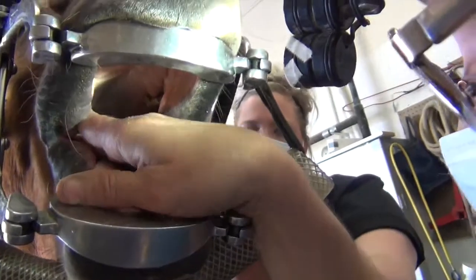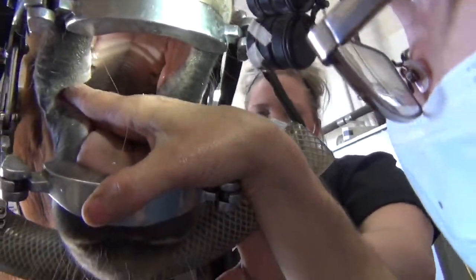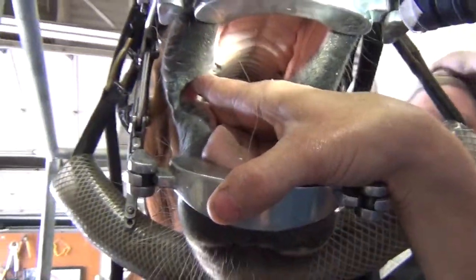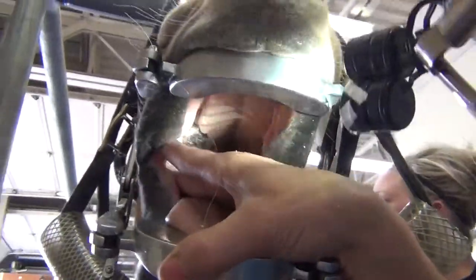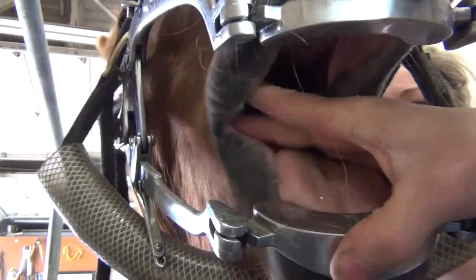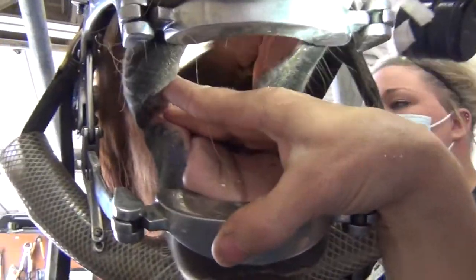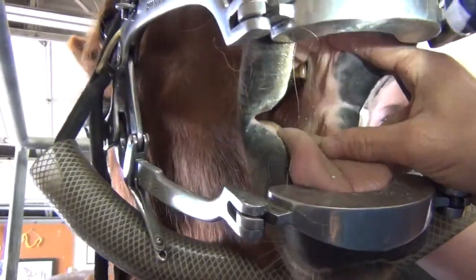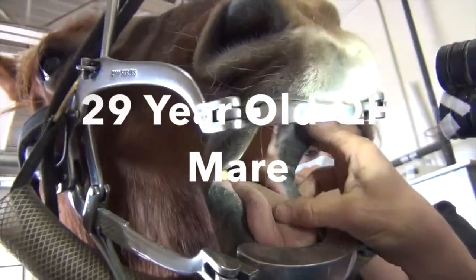for her. One of the things we look for when we're looking at the teeth is how well are they aligned and how evenly are they worn. And if there's uneven wear, then we're going to try to help correct that and lower the high teeth. And she's got pretty good alignment, and her teeth look quite good for her age.